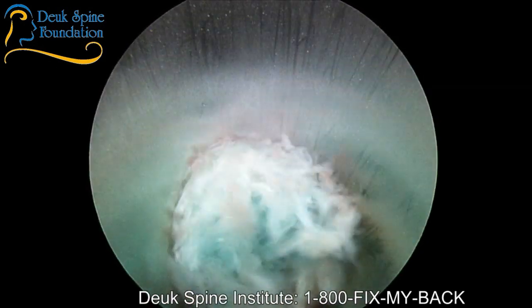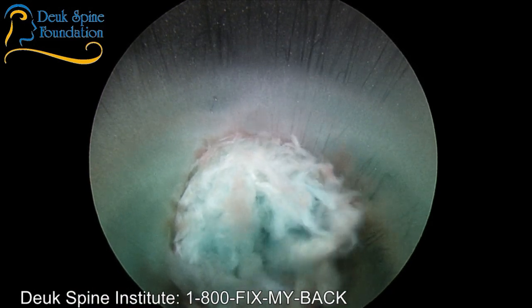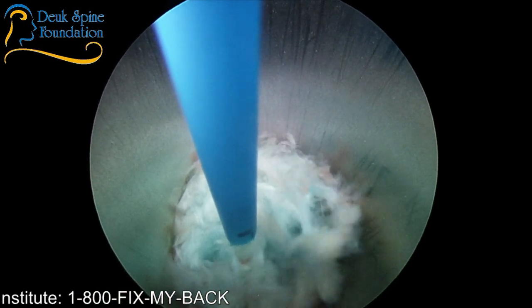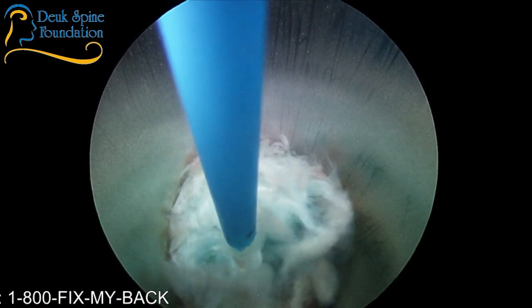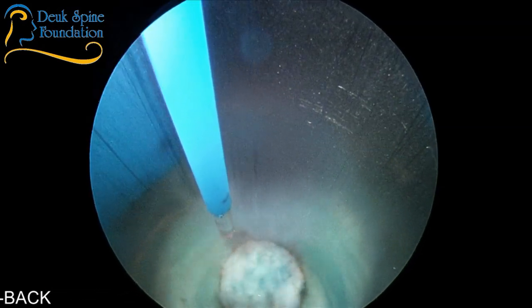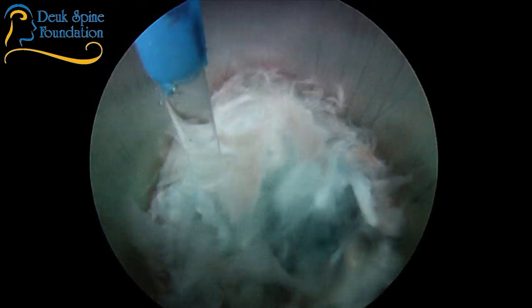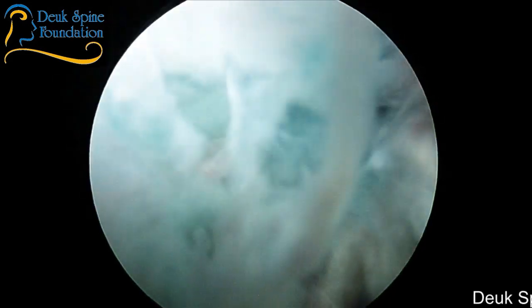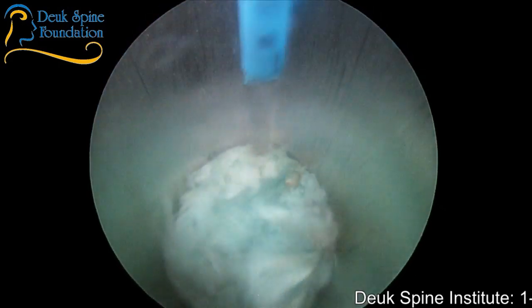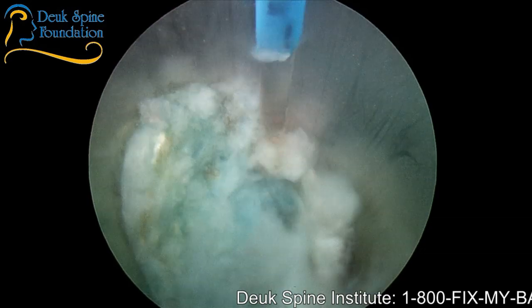So why is it blue? It's blue because we use a vital dye during our discogram procedure to stain the tissue. The vital dye stains the degenerated nucleus pulposus. It will not stain a normal nucleus pulposus, which is white. So if you see a white nucleus pulposus, it's either scarred heavily or it's normal. And this is blue, so it's not normal. This is part of the herniation, and that's why the dye is so helpful. It helps me see what's normal and what's not normal.